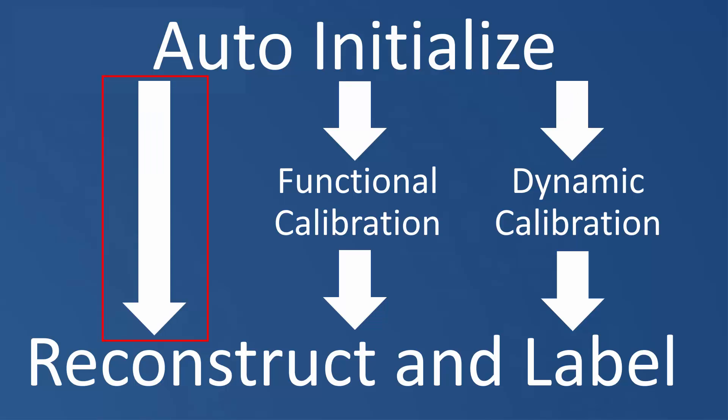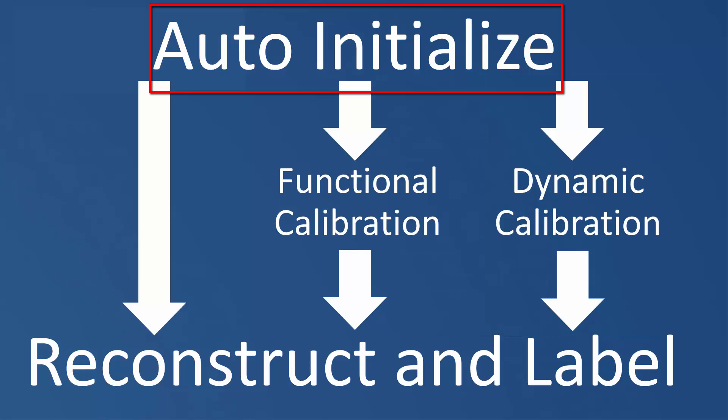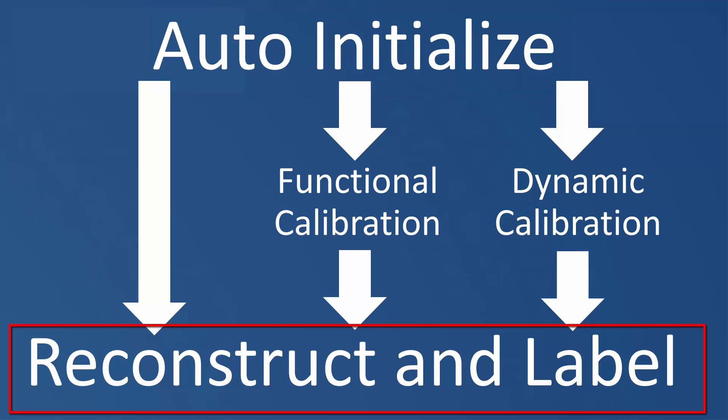The remainder of this video will be split up into three sections. The first workflow is where we will be using the static calibration, which we have just completed, to auto label a trial with a small range of motion. In the second workflow, we will be performing a functional range of motion calibration, and then using the functional calibration to auto label a dynamic trial with a larger range of motion. And in the third workflow, we will be using a dynamic trial as our functional calibration. I'm now going to use the static calibration that we performed in the previous step to reconstruct and label a dynamic trial with a small range of motion.